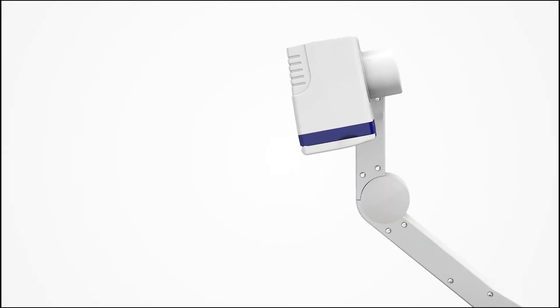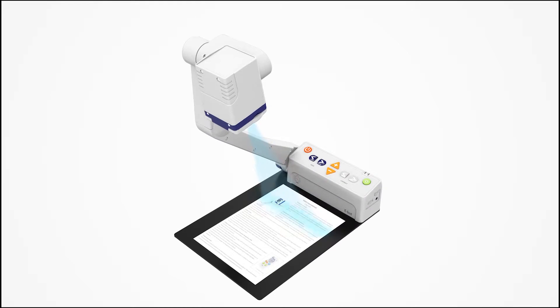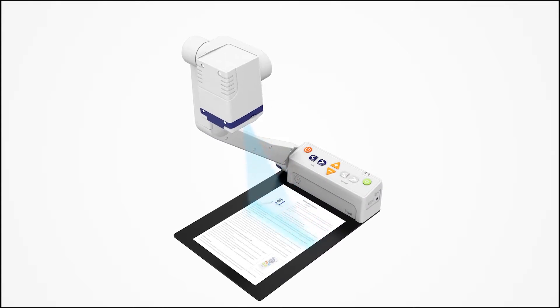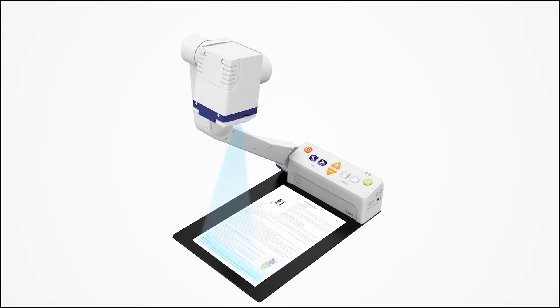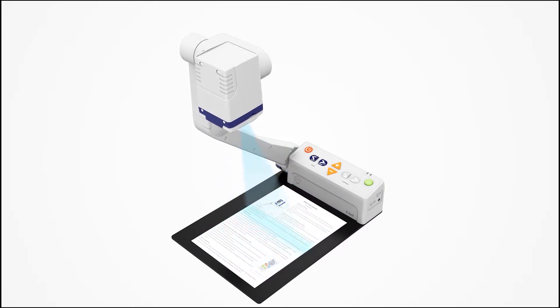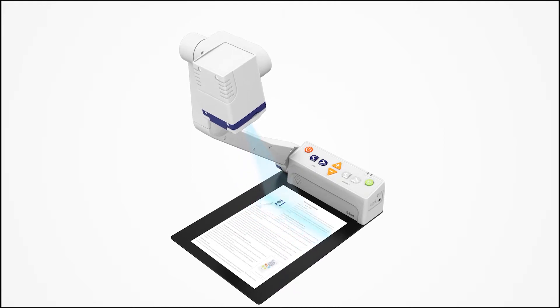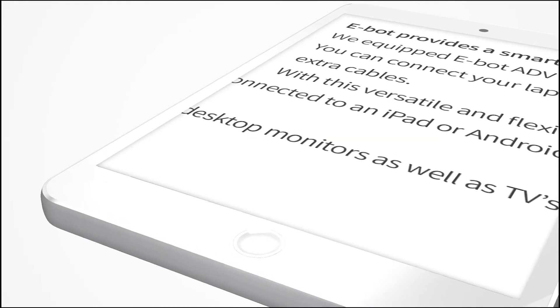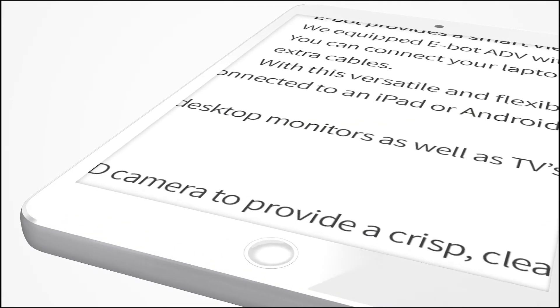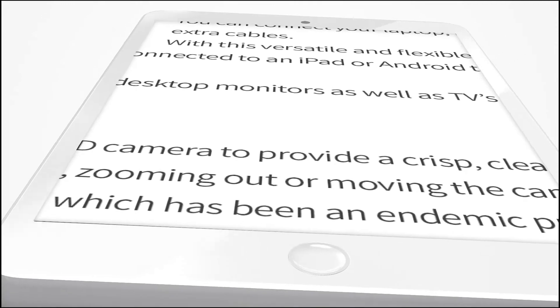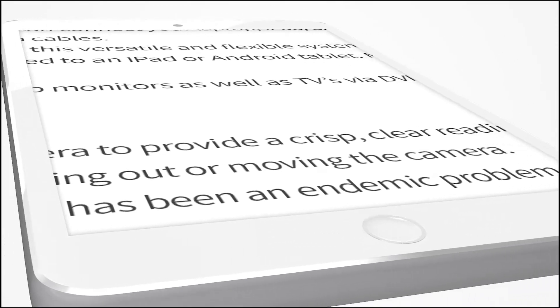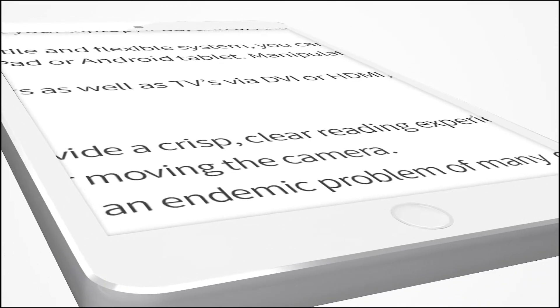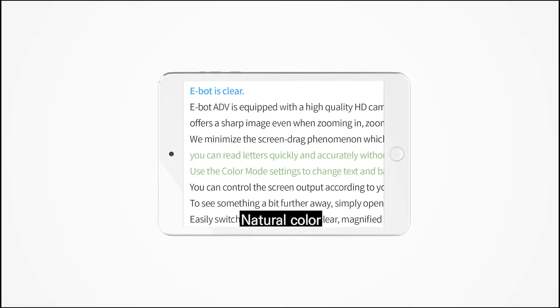We minimize the screen drag phenomenon which has been an endemic problem of many conventional magnifiers, so that you can read letters quickly and accurately without eye strain or fatigue, even after reading for long periods.